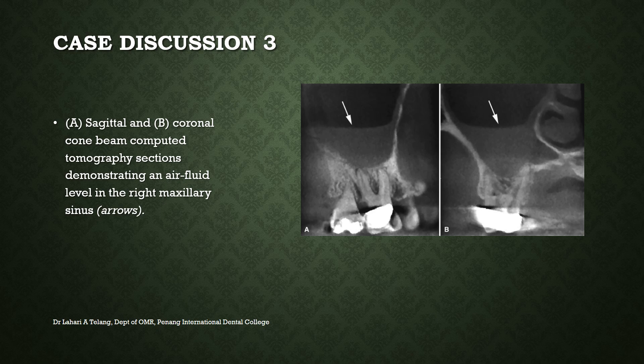This is another case with slices from a cone beam CT scan, where arrow marks point towards an air-fluid level indicating sinusitis. Specifically, the right maxillary sinus is showing fluid levels, indicating it as the cause of sinusitis.